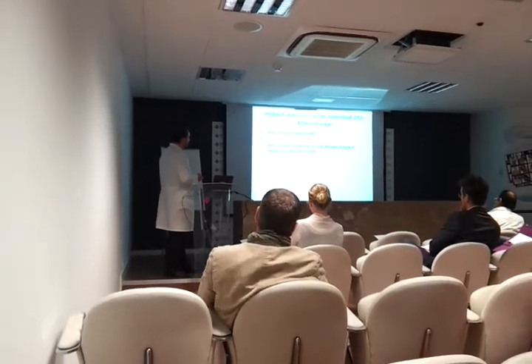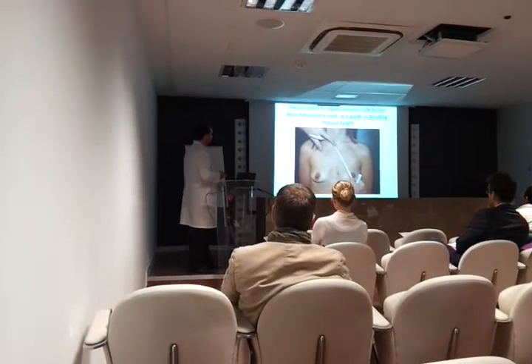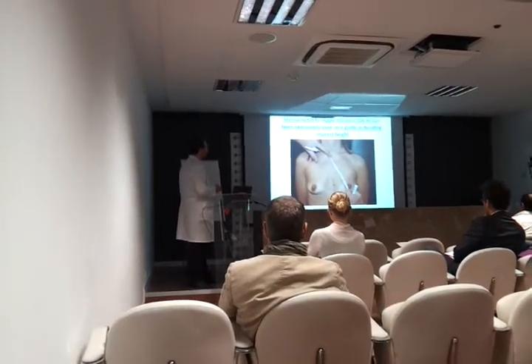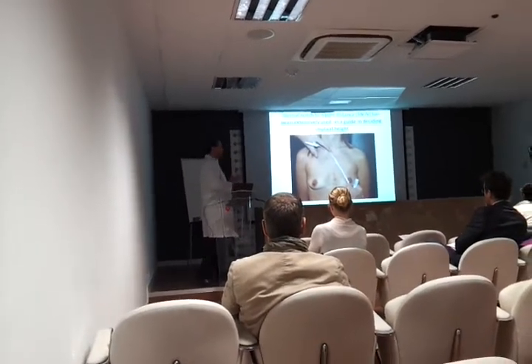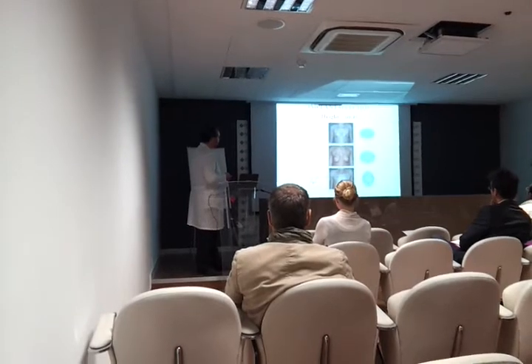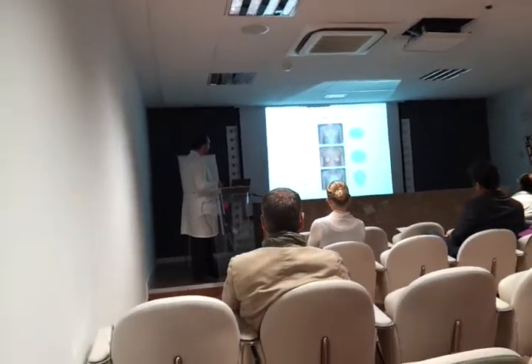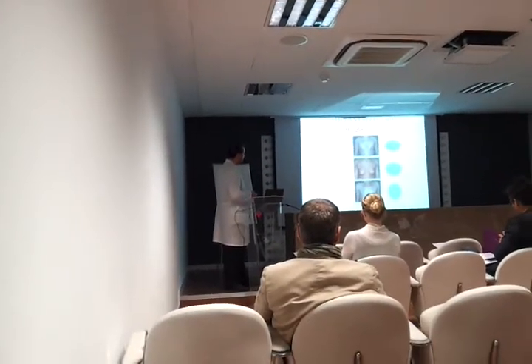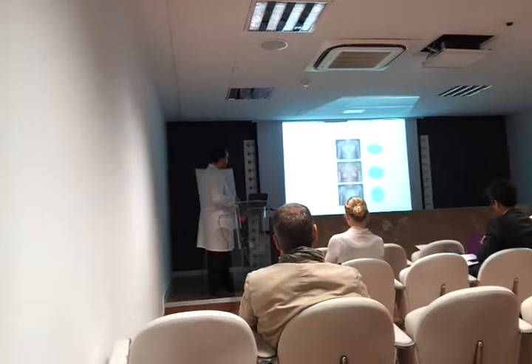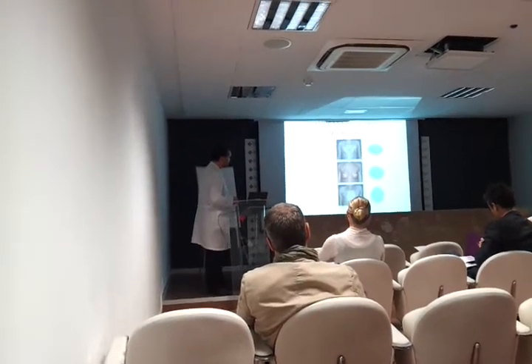The implant height. Sternal notch to nipple distance has been extensively used as a guide in deciding the implant height, and I still use it. If it's less than 17 centimeters, I use a low implant. If it is between 17 and 22 centimeters, I use a medium height implant. And if it's over 22 centimeters, I use a high height implant.